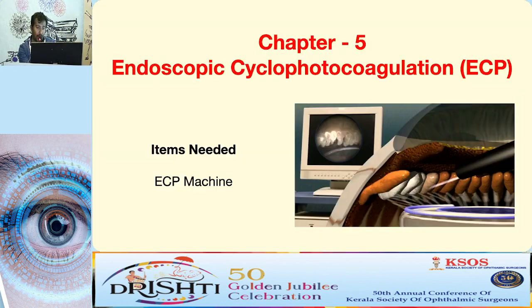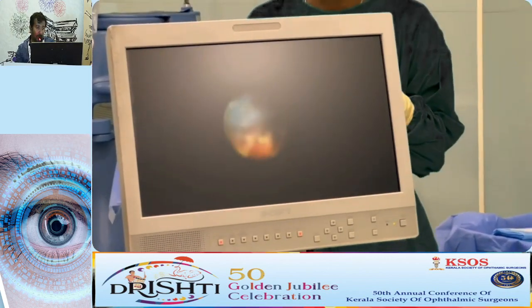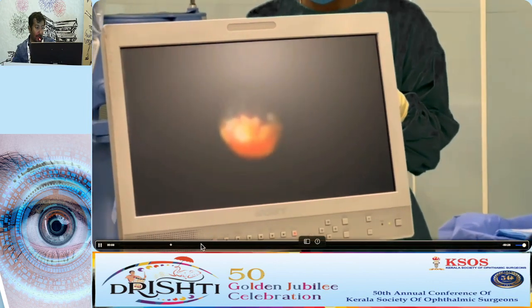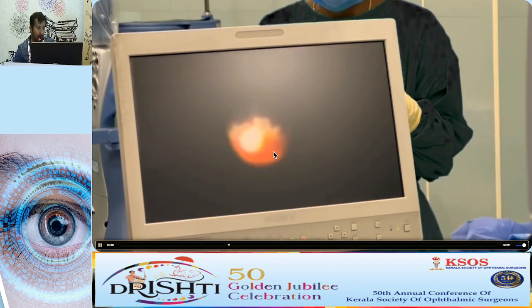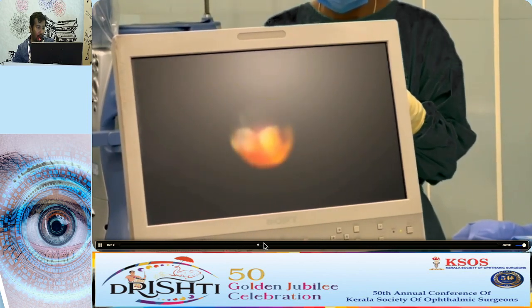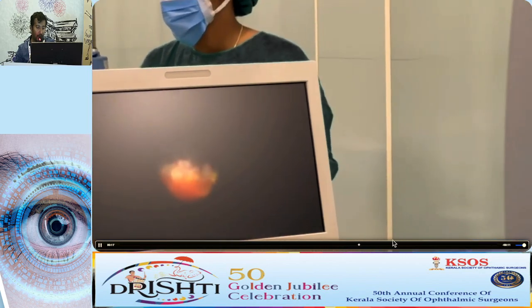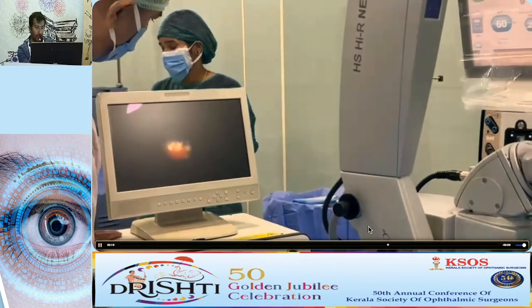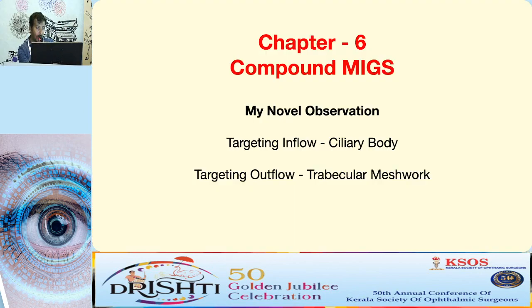And one of the other MIGS, technically MIGS, is the endocyclophotocoagulation, where you use an ECP machine and you go in with the endoscope, an endo-ocular endoscope, with which you can see the ciliary body, and you can laser the ciliary body. You can cyclophotocoagulate the ciliary body and reduce the aqueous production. So you are tackling not only the outflow, you are tackling the production also directly.